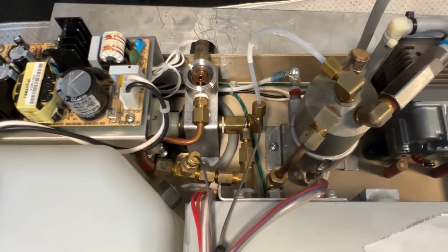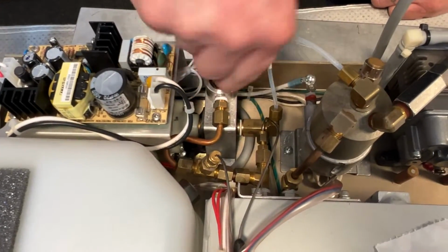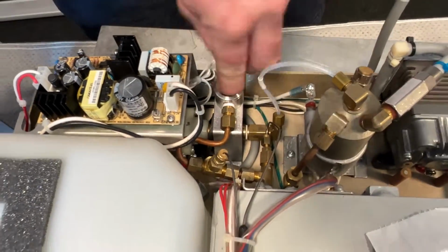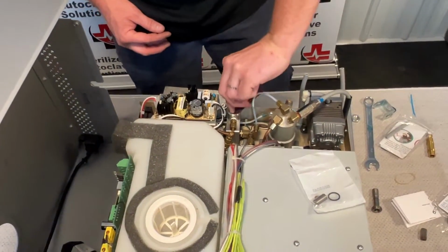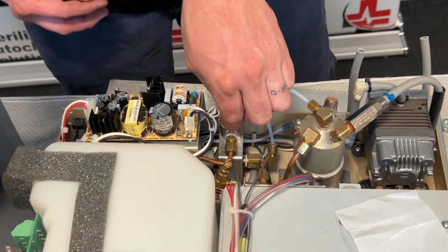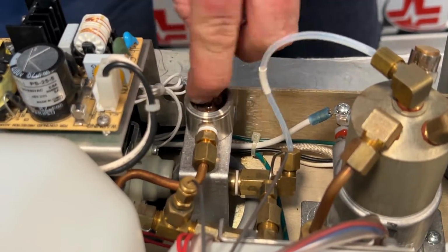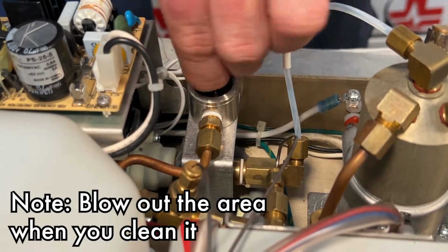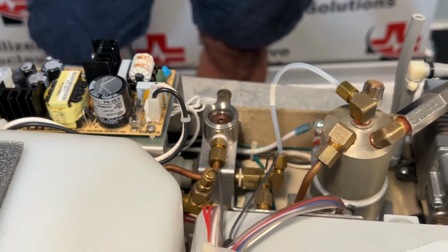And I'm going to use that same Scotch-Brite pad and clean this up a little bit. And make sure that stem is nice and clean. If you have a vacuum or suction or a compressor or anything like that, it works best at the end to blow this out. In the shop, that's what we use, but in here I do not, so I'm just going to blow it out.